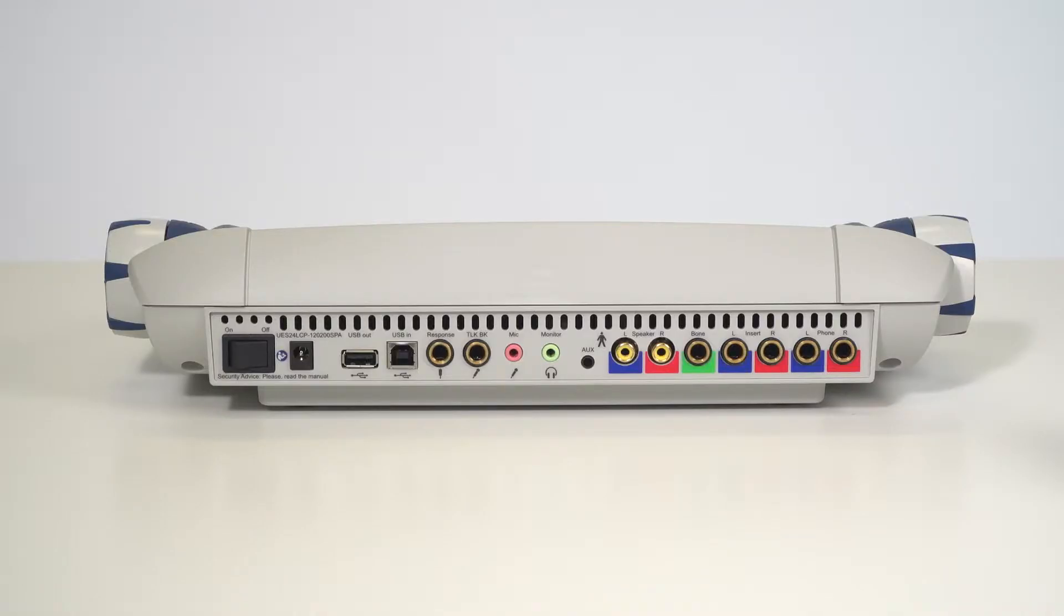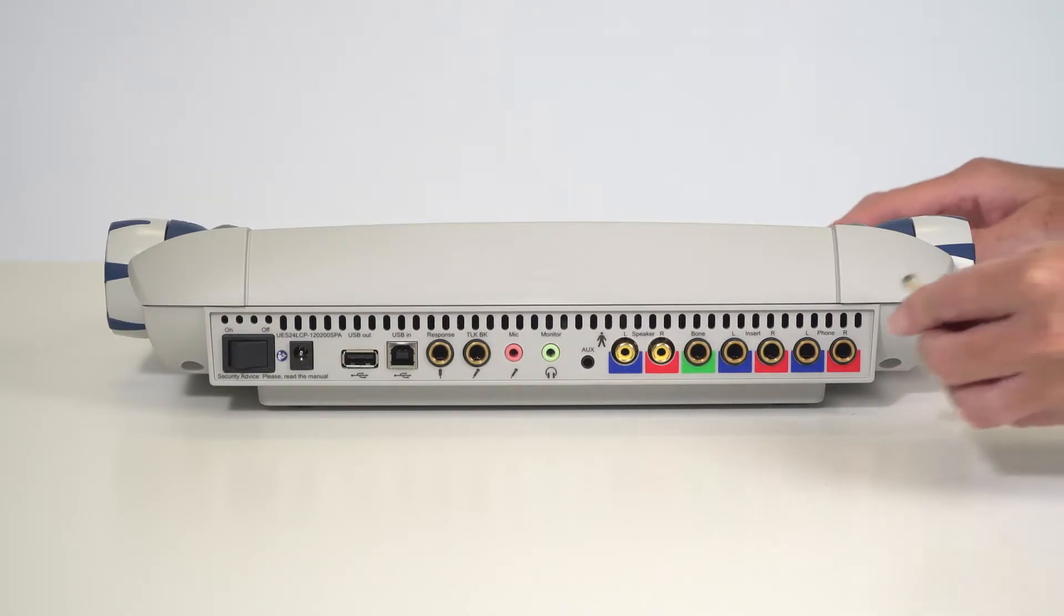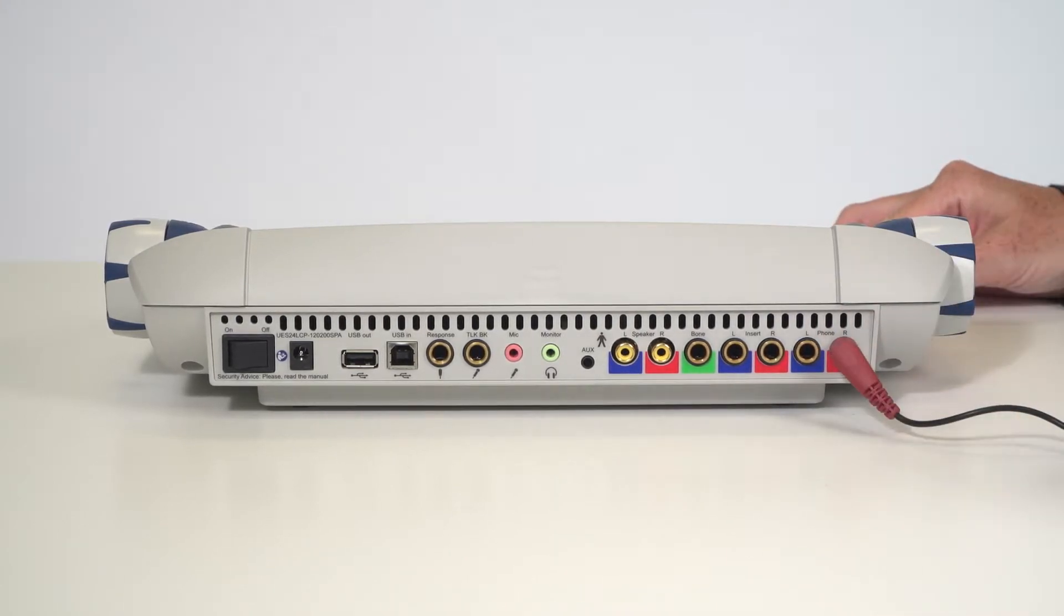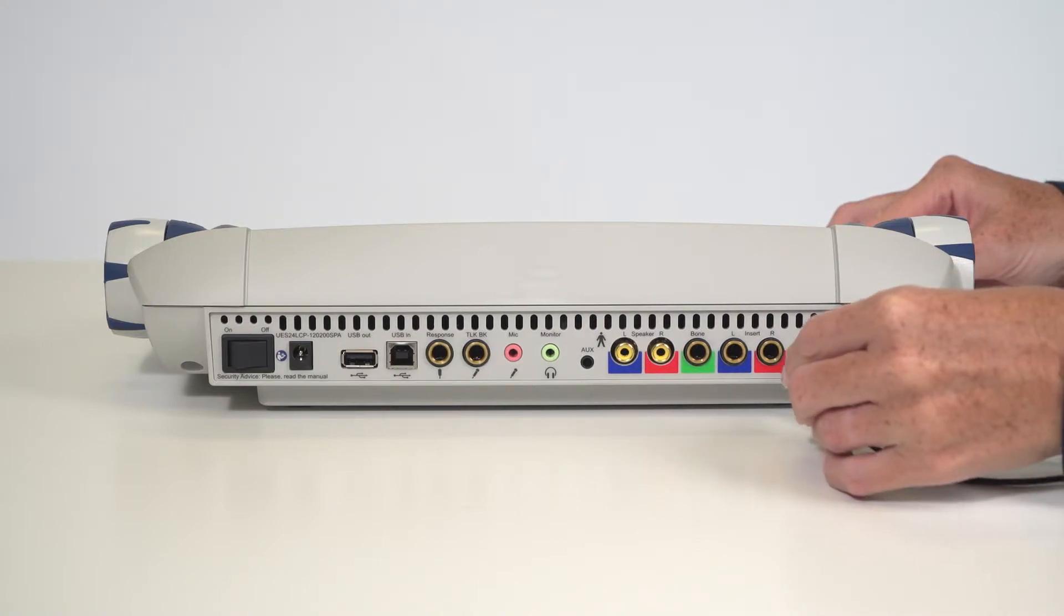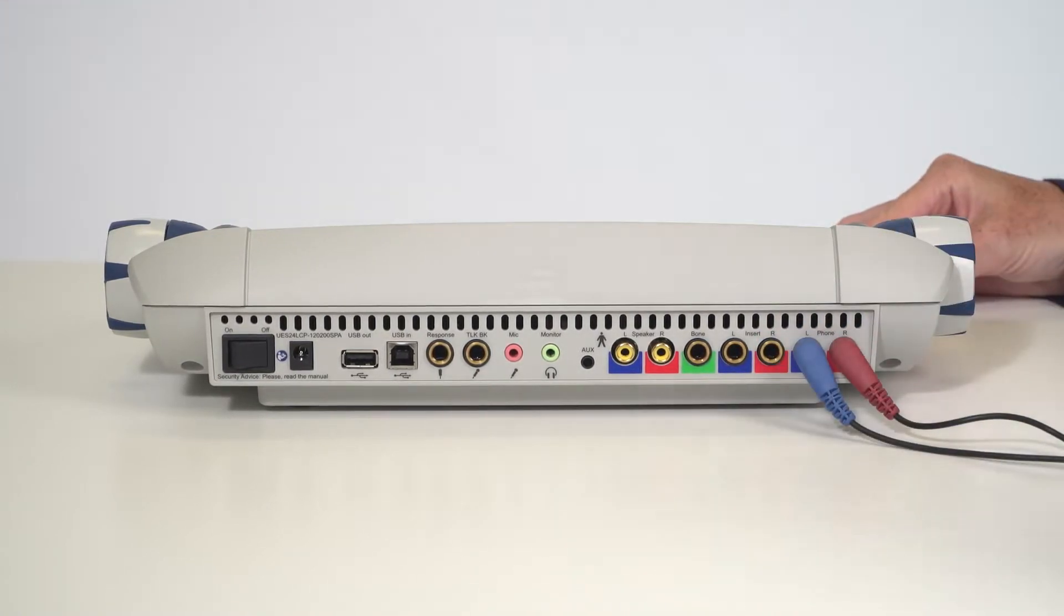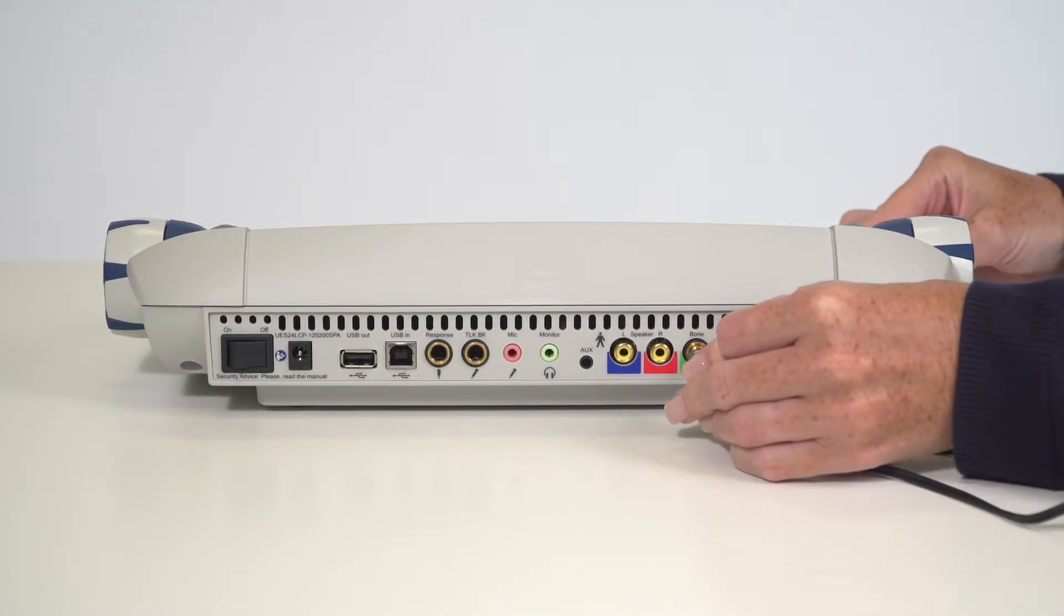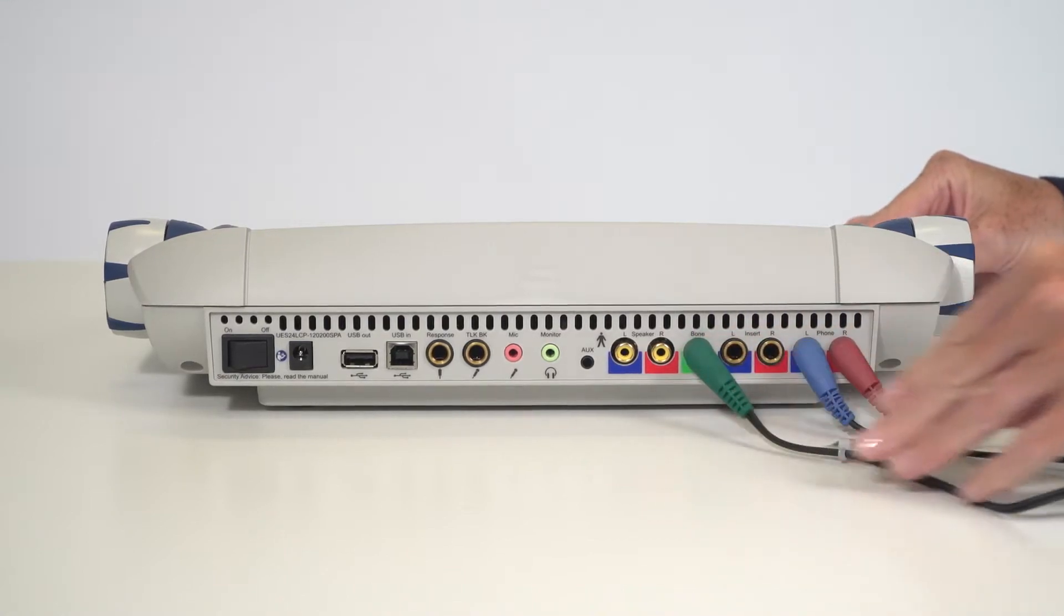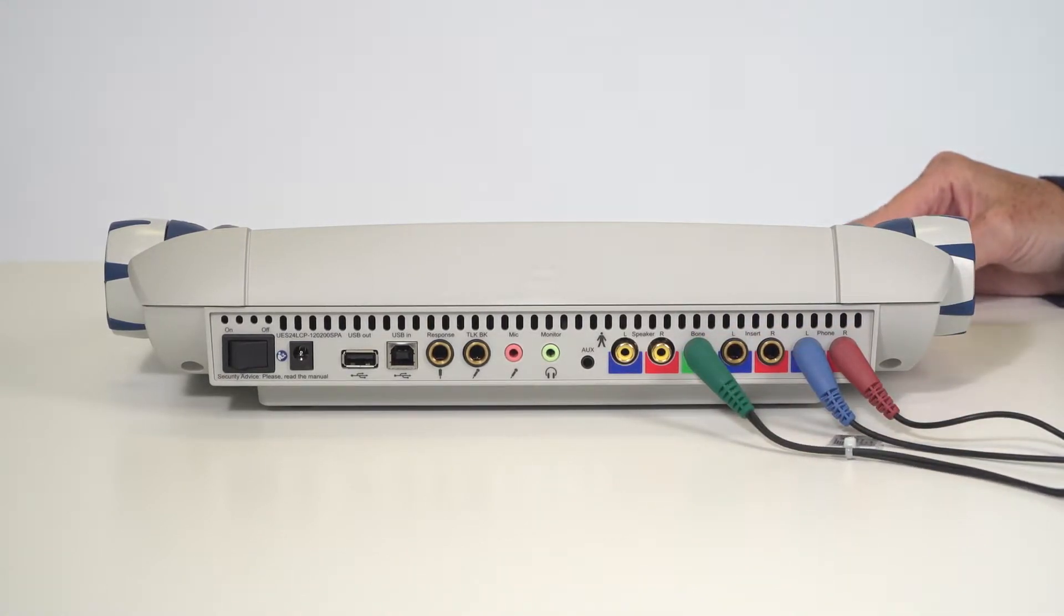To get started, locate the sockets on the back of the unit. The headphones come specifically calibrated to the base unit. When using headphones, insert the red plug into the phone socket labeled right and insert the blue plug into the left socket. Insert the green plug of the bone oscillator into the socket labeled bone.